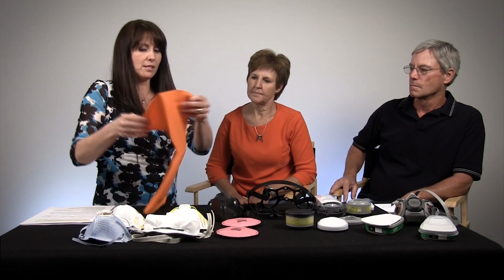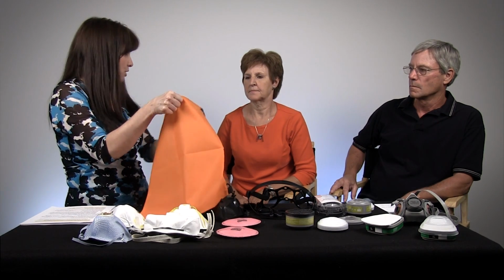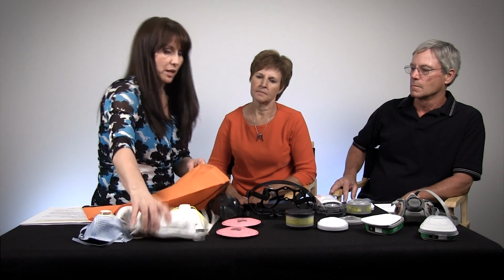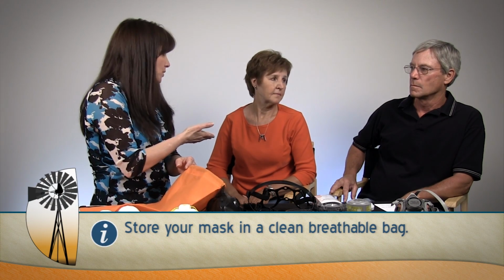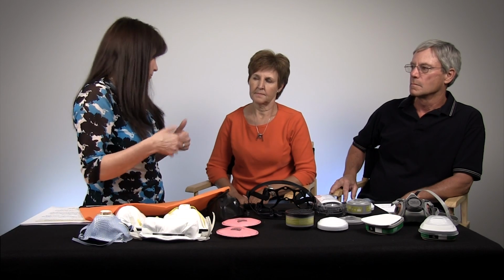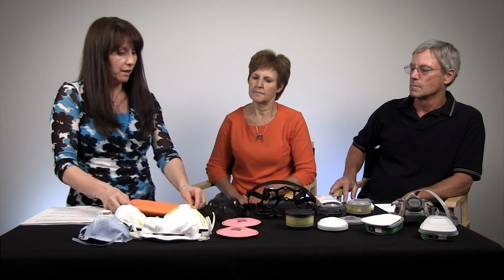And so we have an excellent idea here. It's a small sack that actually is breathable, and that's important. If you have a mask that's wet, you need to make sure that it's dried out before you store it. Particularly when you talk about your coffee can, those types of things. If you put that lid on when the mask is moist, then maybe you're going to grow some types of bacteria. We would be concerned about that. So any type of storage that you can think of that is available, convenient, that's important, and also safe for the type of masks. So once again, we're going to talk about getting the right mask with the right job with the right fit.